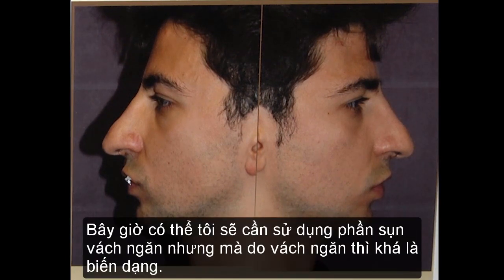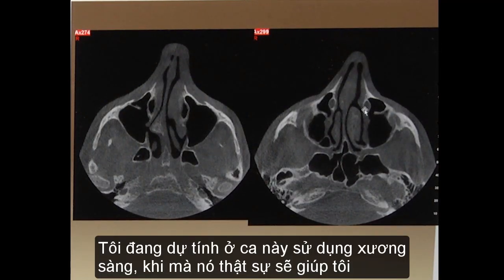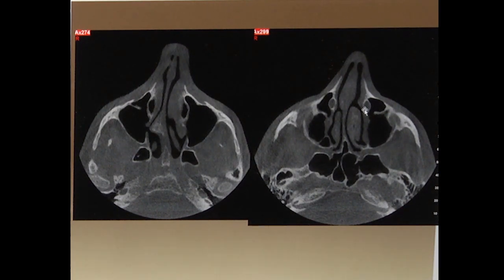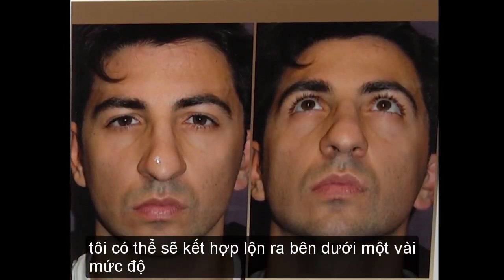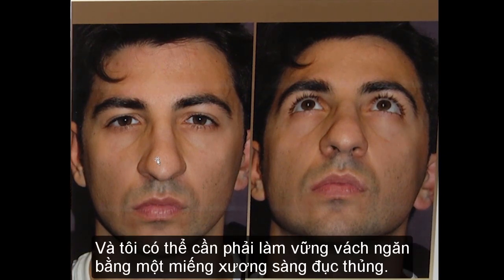Now, since my septum is really so deformed, I am planning in cases like this to use a perforated ethmoid plate, since that will really help me in keeping this septum straight. So the mainstay maneuvers which I plan to do are full degloving, osteoplasty rather than osteotomy, tongue-in-groove or a septal extension graft together with lateral crural struts. I will probably associate some degree of underlay, which is a turn under of the lateral crura since they are so bulky, and I may have to strengthen the septum by straightening it with a perforated ethmoid plate. So this is my planning.